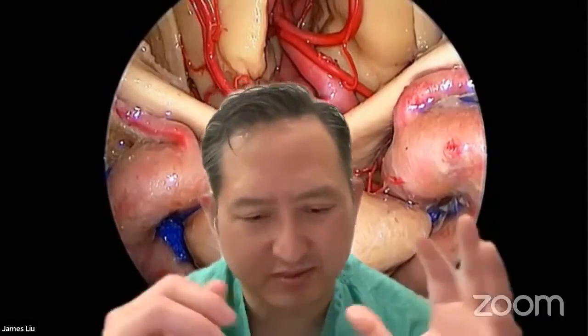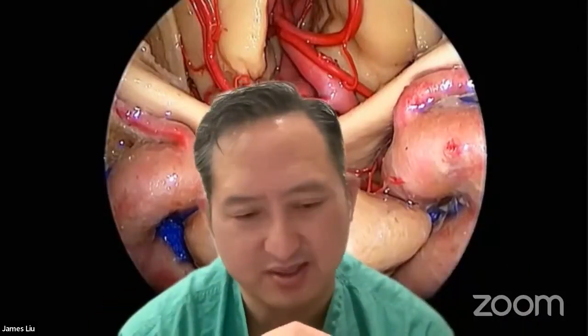So those are different variations that you can see. We call it extracapsular, subcapsular. We always try to dissect it out with the suction or with the curette and remove it. One more thing, I totally agree with you. Many times we feel that this tumor may be extending laterally or suprasellar and you may not be able to remove it from transsphenoidal, and yet we are able to remove it in the majority of cases.